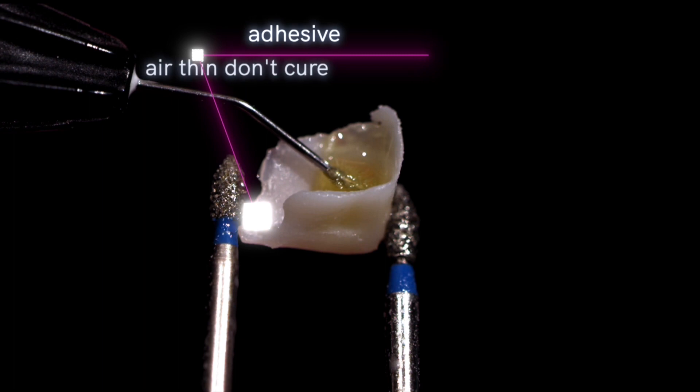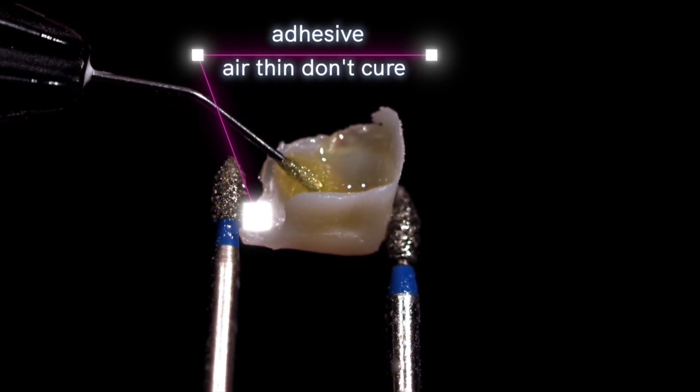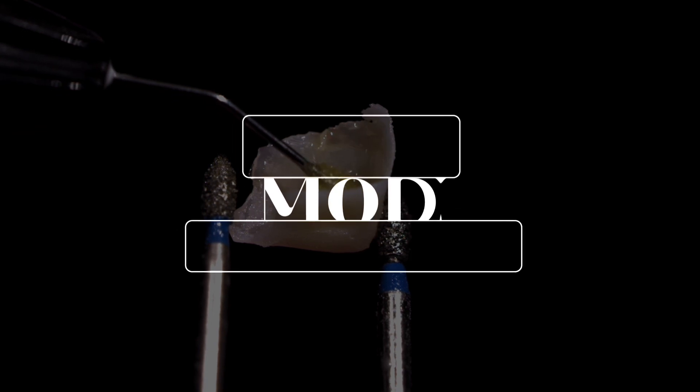After you do silane, I like to scrub the inside of the prosthetic with adhesive. Here, I'm using Adhese Universal. You are not going to cure this — you're going to air thin it only and load it with your resin cement.